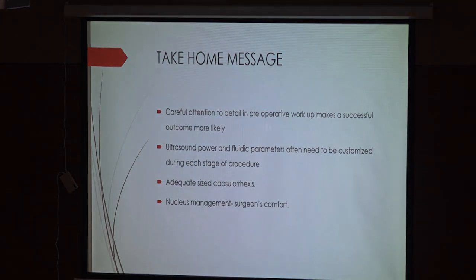So the take home message from my talk is that careful attention to preoperative workup will make your surgical outcome better, and you have to modulate your power and fluidics during the phacoemulsification depending on the hardness of the cataract, and capsular rhexis has to be of adequate size. And then nucleus management has to be as per surgeon's comfort.